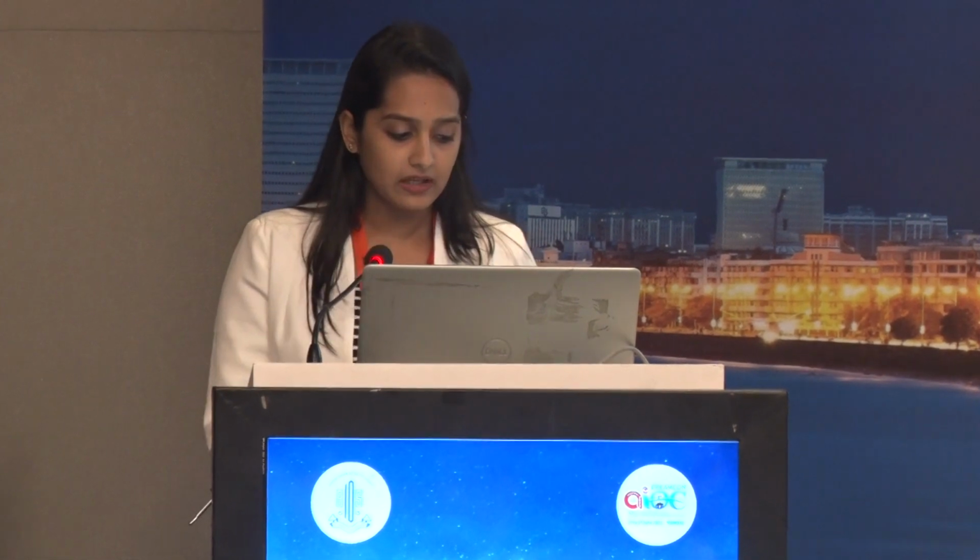Eversion of eyelids is a common procedure done as a part of a routine ocular examination. It is performed with the help of the index finger and the thumb of one or both hands. It can also be performed with the help of cotton buds.